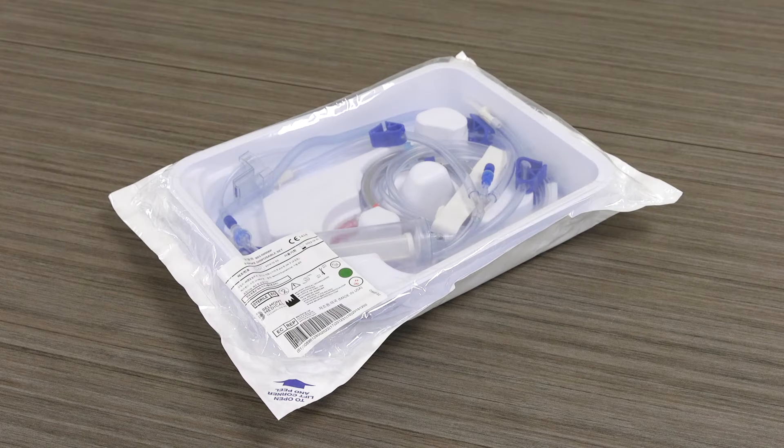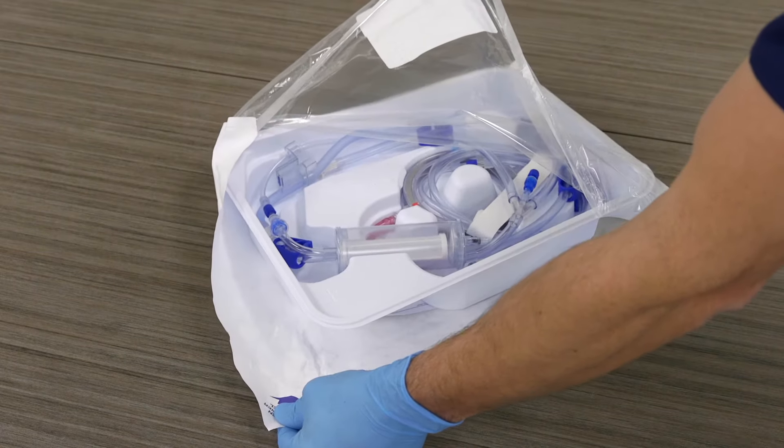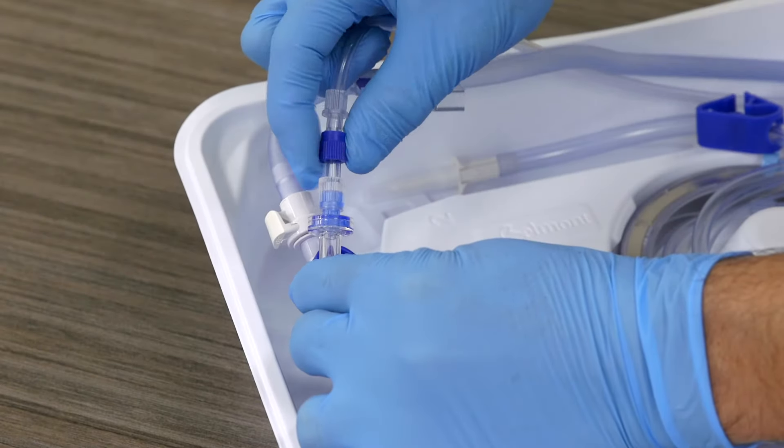The single patient use disposable comes preassembled in a sterile container and is color-coded for easy installation. Begin by opening the disposable package and tightening the two lure locks.